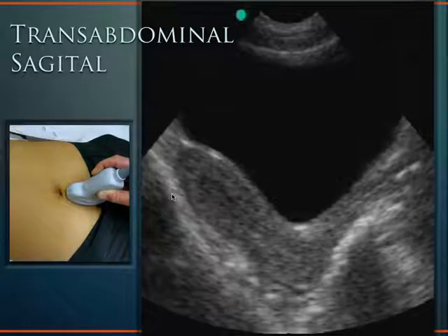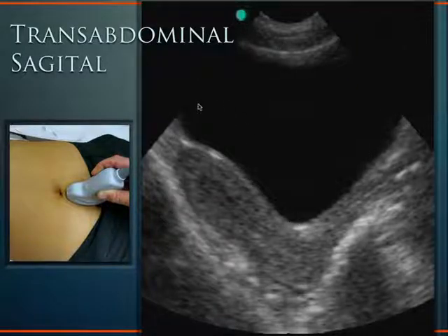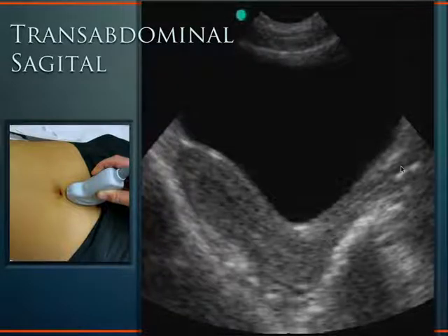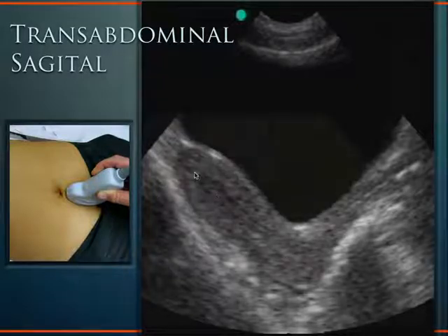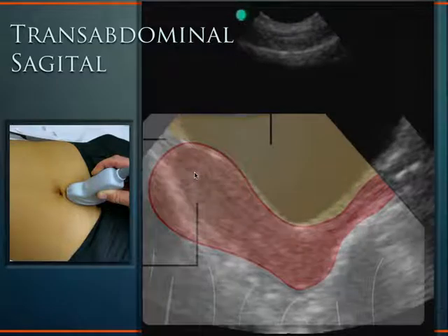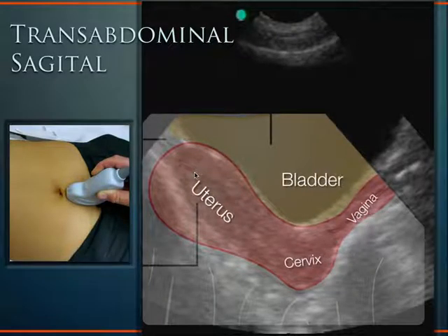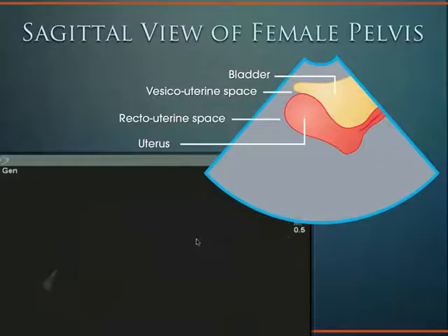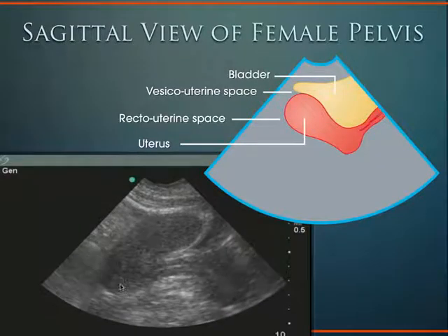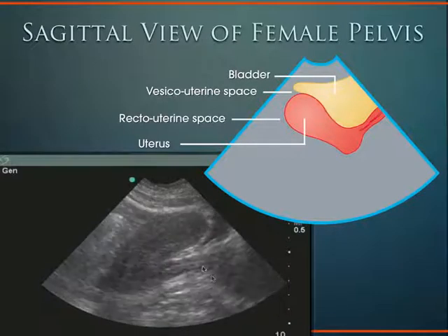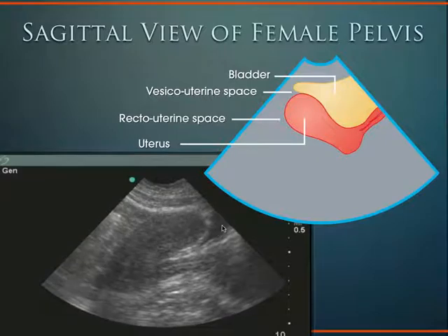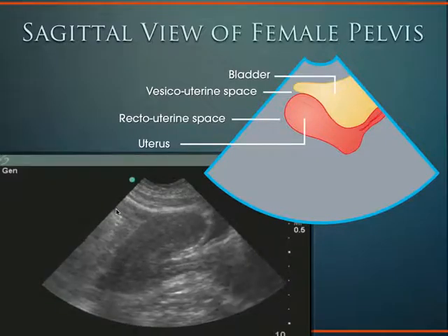In the transabdominal sagittal approach with indicator towards the patient's head, the bladder appears triangular. You can see the uterus, the cervix, and the vaginal stripe terminating at the cervix, with the anteverted uterus coming up. When the bladder is empty, the uterus is nearly 180 degrees on itself onto the vaginal stripe. As the bladder fills, it pushes the fundus of the uterus posteriorly.